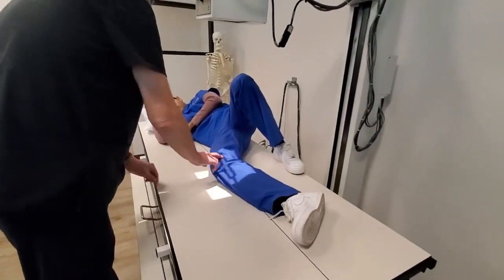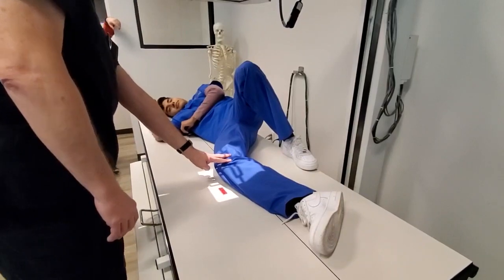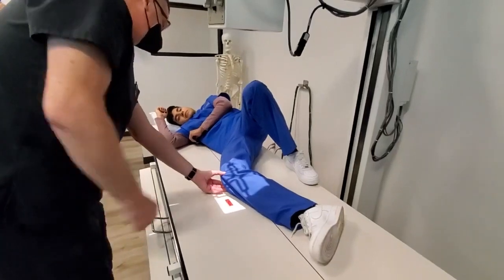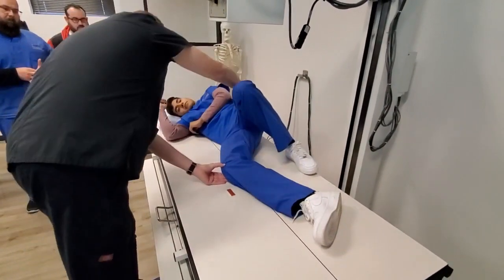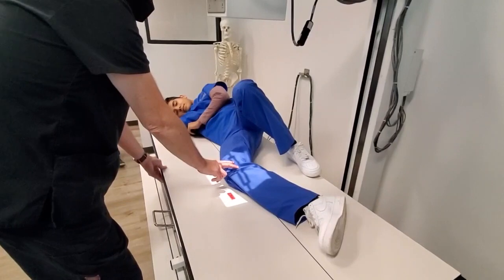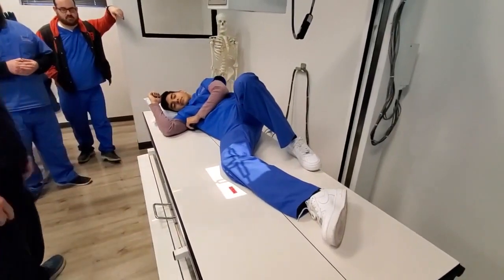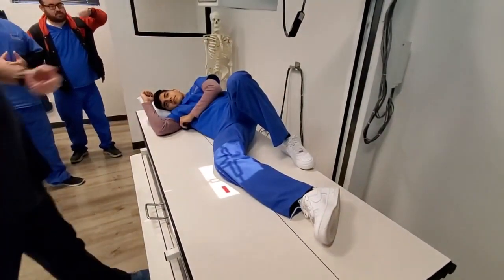Central ray goes to the medial epicondyle. We want the epicondyle perpendicular to the IR, and the patella perpendicular as well. Palpate the borders — I can feel the lateral border is a little more anterior, so bring your hips down just a little. Be sure they don't rotate the leg over too much. I can feel the medial and lateral borders of the patella are perpendicular. We're lined up. Patient instructions: hold still, don't move. One thing we didn't do — shield. You would obviously have the patient shielded for all of this.